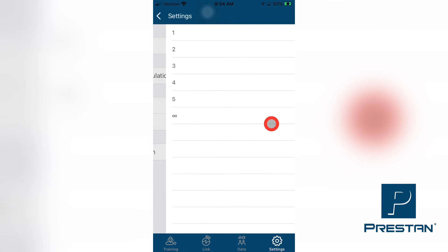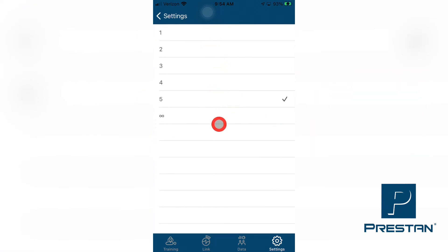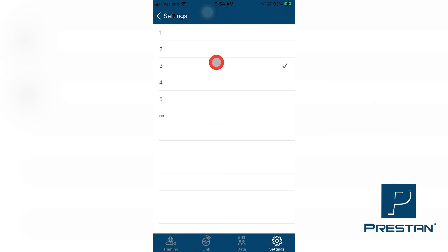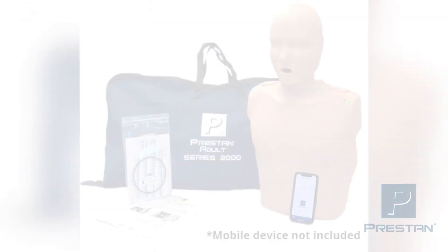Lastly, the instructor can choose how many cycles of CPR are to be completed during a simulated cardiac rescue scenario before the app automatically ends the training and saves the data.